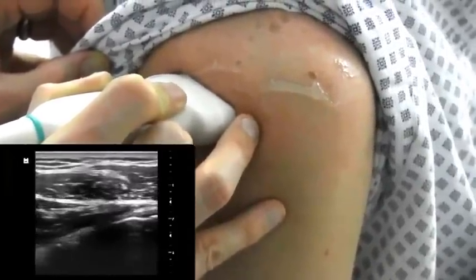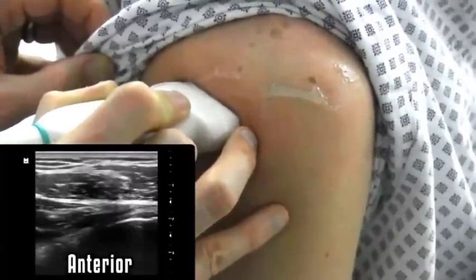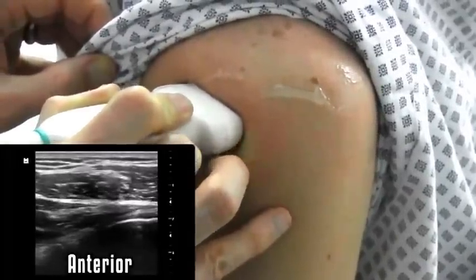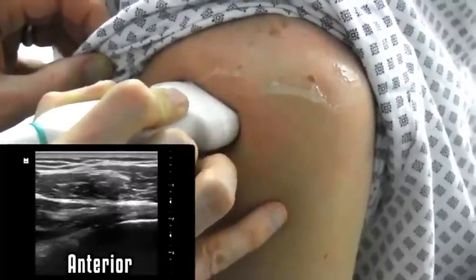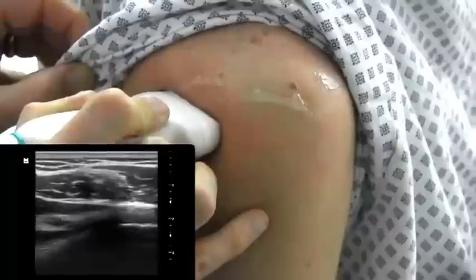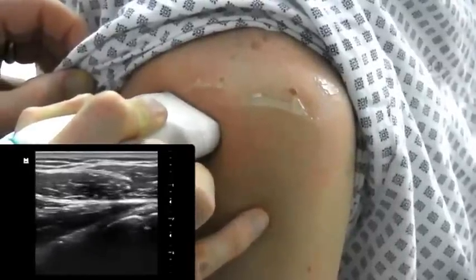If the humerus is anterior to the glenoid, this is pathologic and this is an anterior dislocation, which is more common.